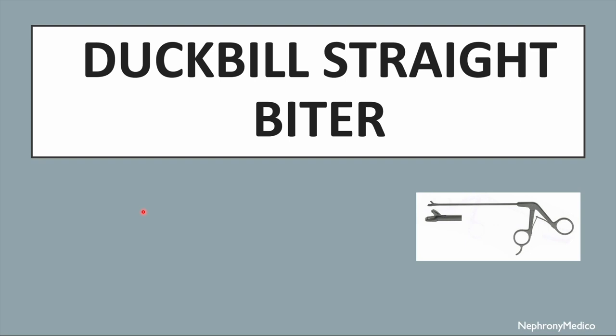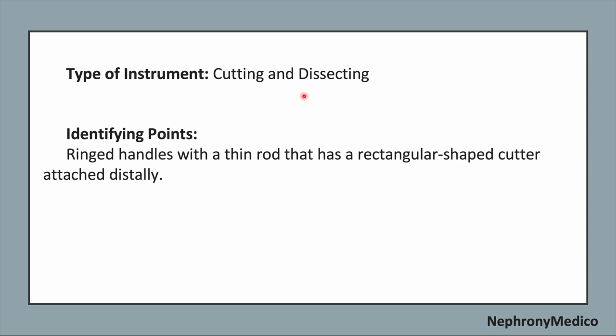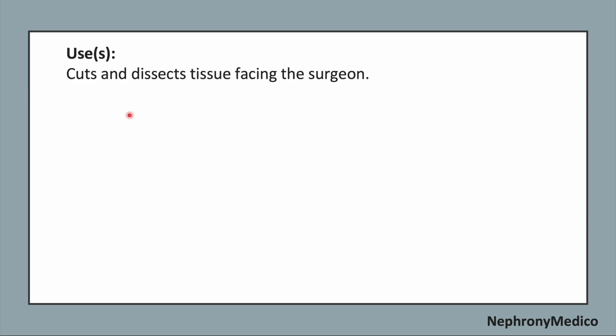Let's talk about duckbill straight biter. This is a picture showing a duckbill straight biter. It is a cutting and dissecting type of instrument. Now, identifying points of this instrument. The ringed handles with a thin rod that has a rectangular shaped cutter attached distally. Use. It cuts and dissects tissue facing the surgeon.